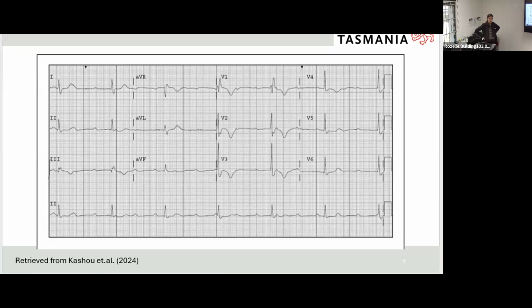You look at the isoelectric line, contiguous leads. Absolutely. And what do you mean by contiguous leads? Leads that are next to each other. Like the views that are next to each other. Good question. So does everyone know the terms contiguous and reciprocal? The facing and things like that. Yeah, you were close though.